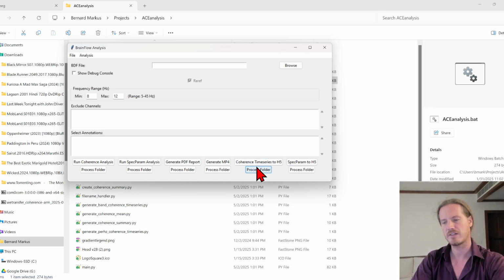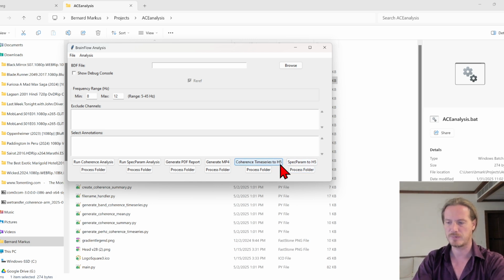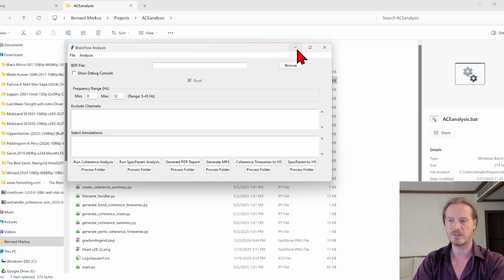It can generate the coherence time series to H5. H5 is a type of file format that is very suitable for saving big time series data. So here we can have the coherence time series to H5, and we're going to see that in more detail in a moment, and also the spec param to H5. So this basically weasels through the whole database and processes any new files.